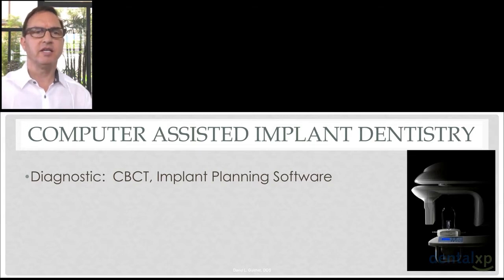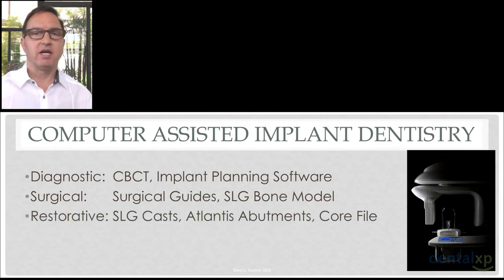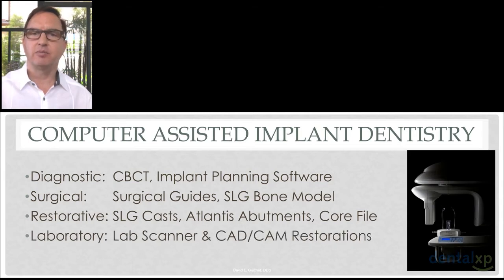We also utilize this software from the cone beam CT surgically, because sometimes we order surgical guides and even make a stereolithographic bone model. Additionally, restoratively, we have the opportunity to make casts, custom Atlantis CAD-CAM abutments, and even the new Atlantis core file or immediate smile restoration and bridge. In the laboratory, we have laboratory scanning, and from those scans we can generate new generation of custom CAD-CAM zirconia restorations, which I'd like to elaborate a little bit more as we go on.